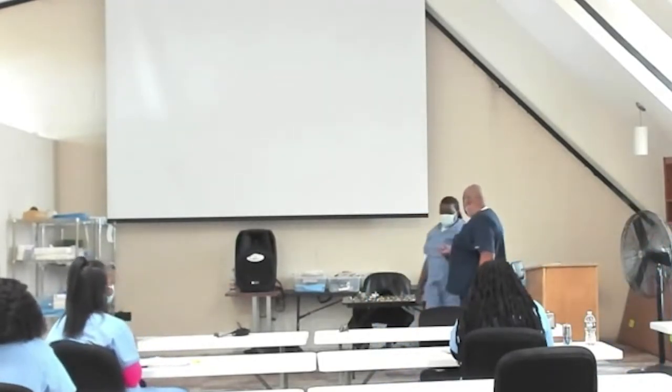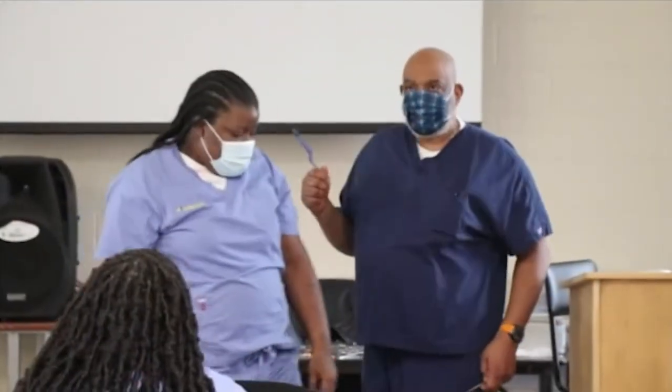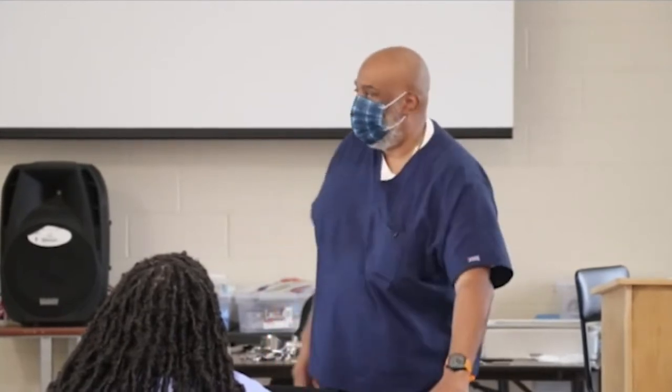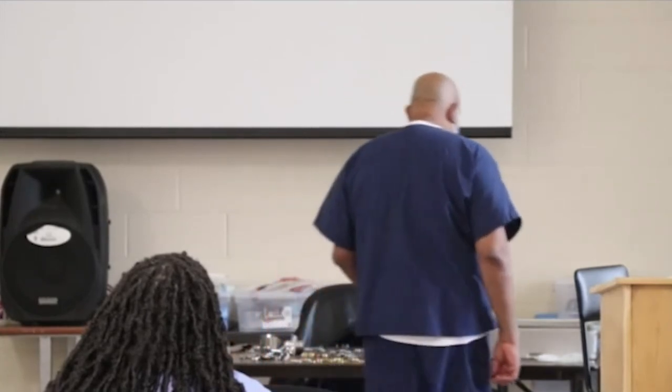And this is the bipolar forcep. Thank you, Shalaya. The difference between your bipolar forceps and the other ones that we've seen so far, when we think of bi, it can go two ways. So the bipolar forcep looks like a bayonet, which you'll be introduced to later, but it has these prongs on it, which connects it to current in the room. All right, great. So these instruments and more.